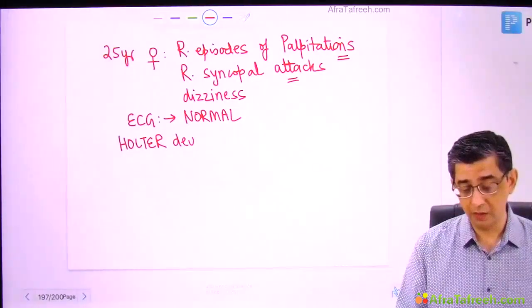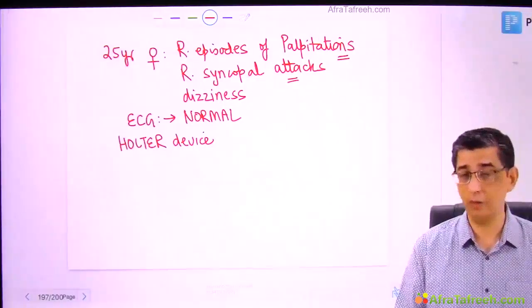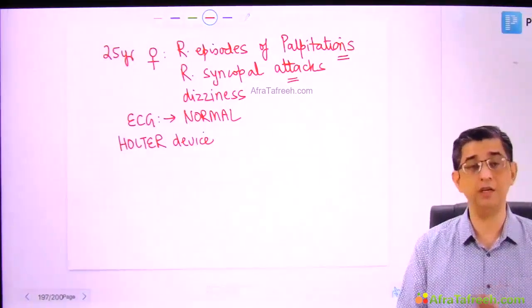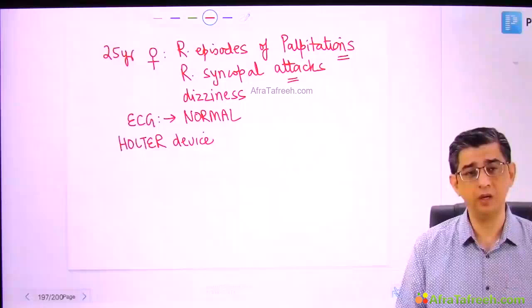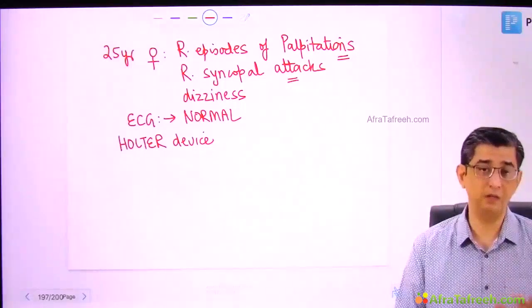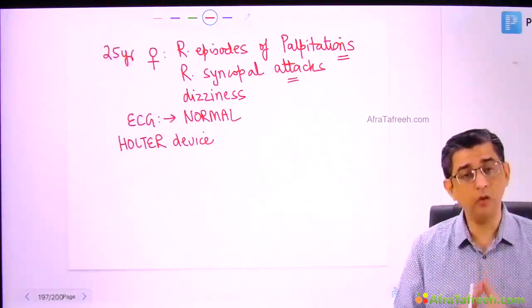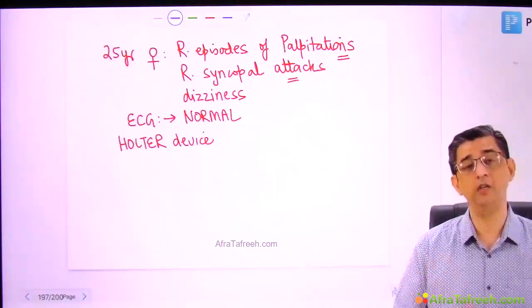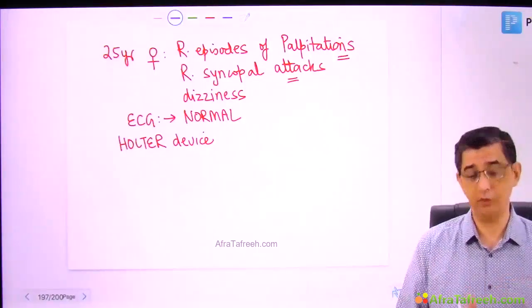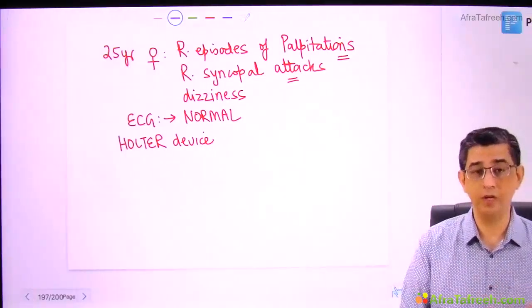Well, in this particular condition, lots of time when the patient will come to you, patient might be okay. There might be no problems in the patient. See, she started feeling dizzy after having coffee, and by the time she reached her clinic, she was okay. Or she was just feeling unwell, but otherwise, in the clinic, she is not unconscious. So when I put the Holter device on the chest of this person, I will be able to record the cardiac events over a longer duration, and because these episodes tend to reoccur, we will be able to pick up the abnormality in the ECG.